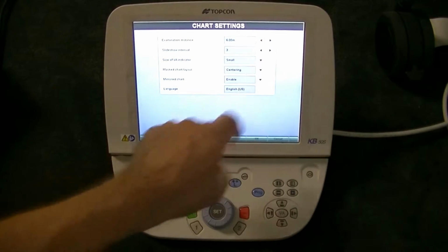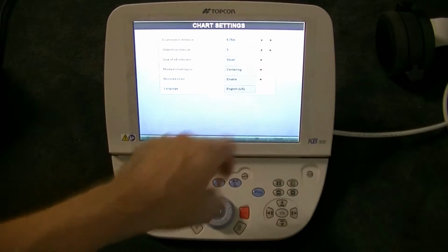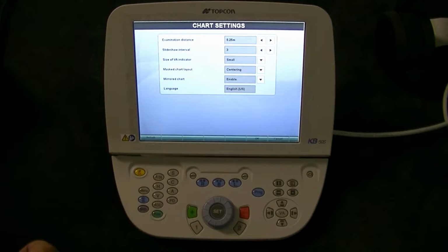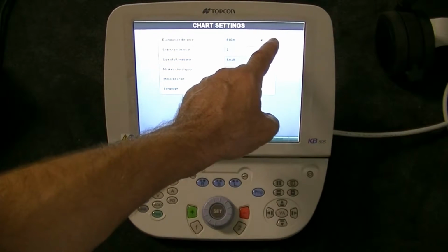If not, you're going to have to select out the meters. 6 meters is about 18.5 feet, 19 feet. 5.75 meters, you have to convert it over. So that's how you get your footage. Use these meter readings to convert it to the actual feet that it is. So for instance, if you had 5 meters, that's about 15 feet, it's almost 16 feet. So you'd use that if you had a 16-foot distance. So you just convert that over, it'd be about 16 feet, a little less. And that's how you would do that. Okay? So let's go over here to 20 feet.